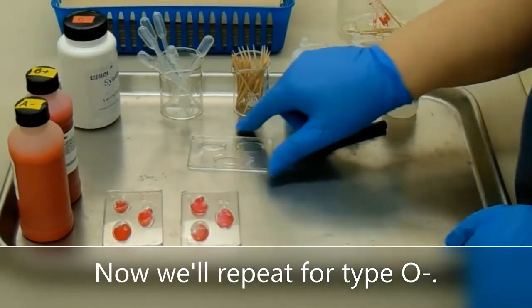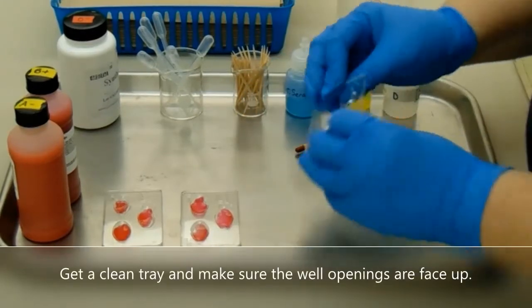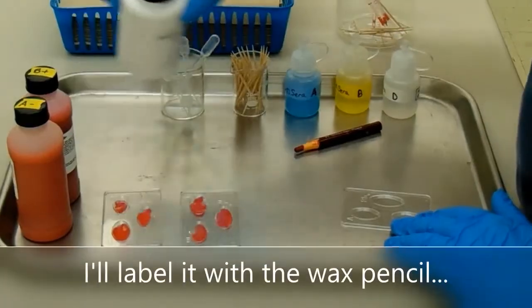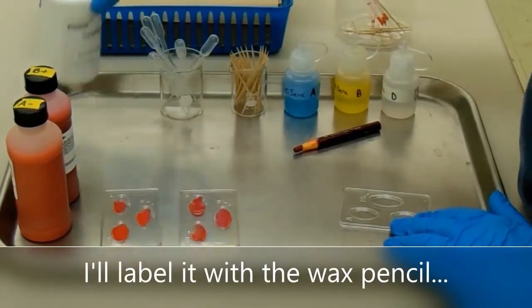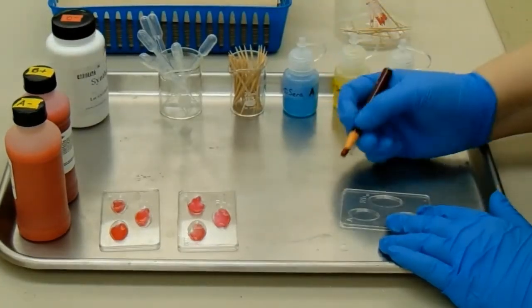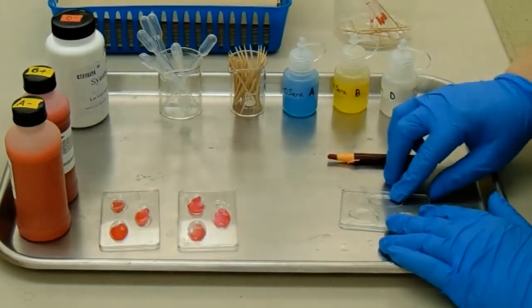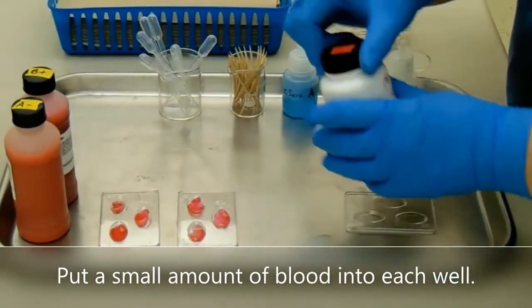Now we'll repeat for type O negative. Get a clean tray and make sure the well openings are face up. I'll label it with a wax pencil.